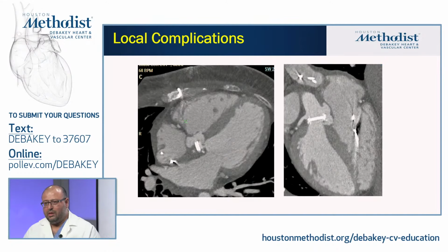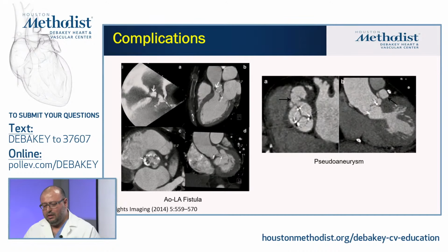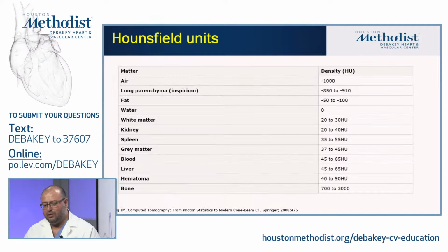So let me show you some of these cases that we sometimes see coming in for CT for confirmation of diagnosis or suspicion by TEE. Here, for example, you have some local complications of abscess and pseudoaneurysms that you can see. You can also look at patients who have a fistula, so this is how it looks when you have an LAO, left atrial to aortic to left atrial fistula, as you see here. We can look also at pseudoaneurysms, as you see in here, and these could be pulsatile if we acquired it in retrospective gating.